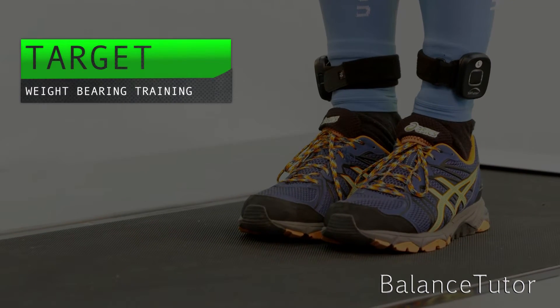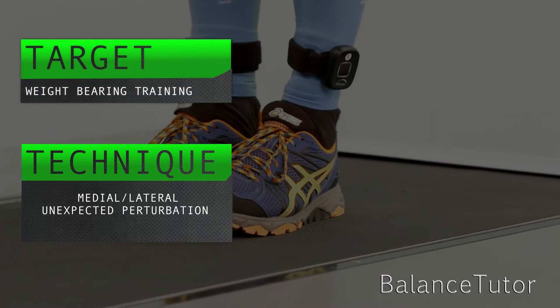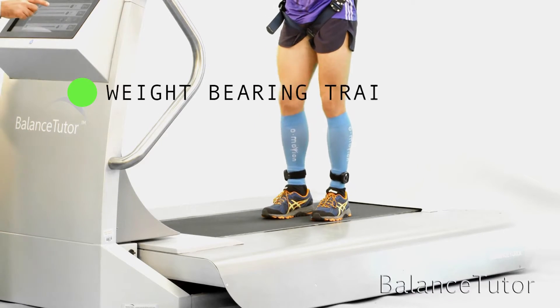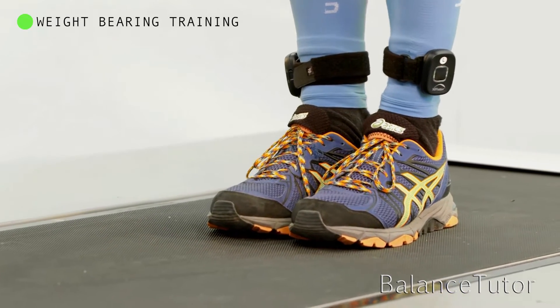Here are a few of the unique treatments possible on the system. The therapist is triggering a sideward perturbation, forcing the patient to react by putting weight on the injured leg.